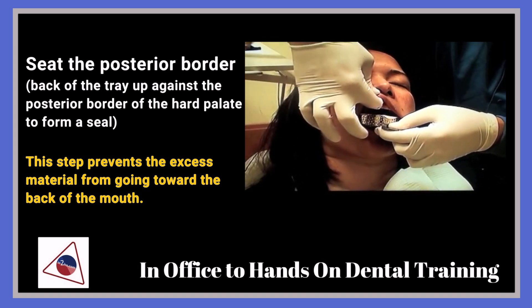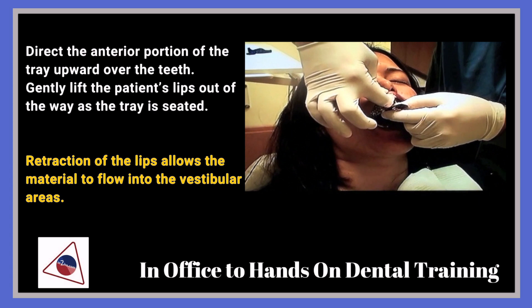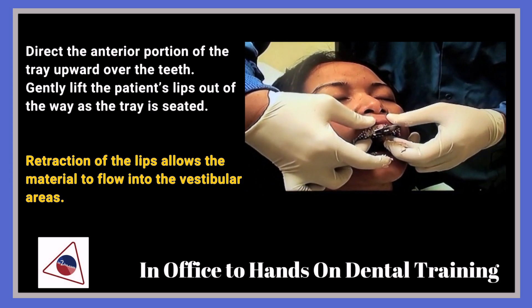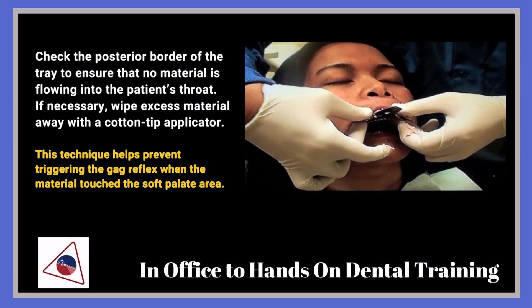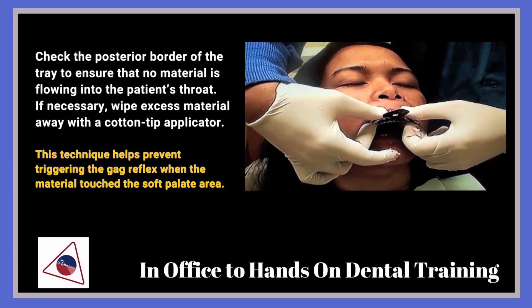Start from the back and relax the lip, then pull the upper lip out. Make sure that you're holding the lip down and the tray at the same time.